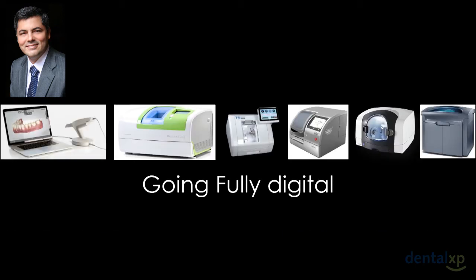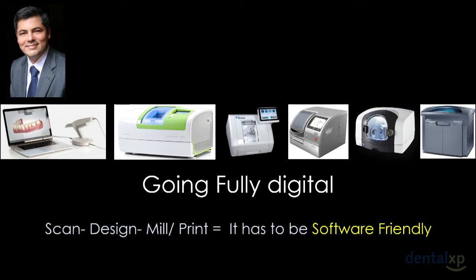So now the big question is, how do we go fully digital? Because now we have technology available, so the technician doesn't have to overnight crowns. We can do the crowns in 10 minutes. We can place the implant, place the abutment, scan the patients, and deliver the crowns. So how do we go fully digital?